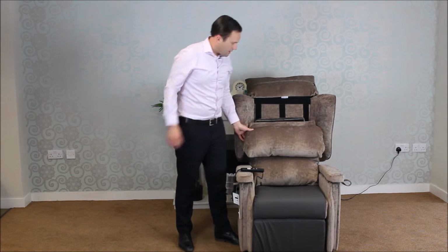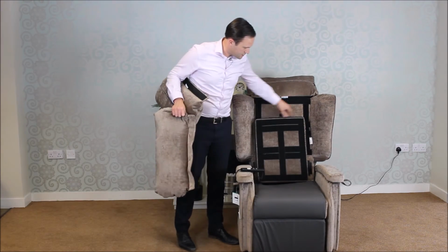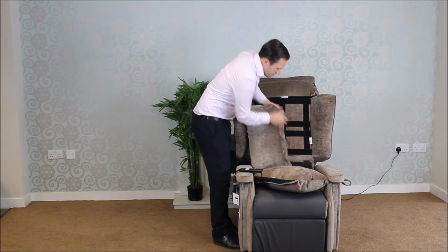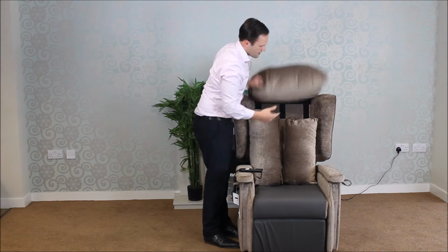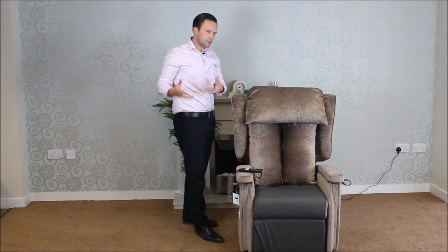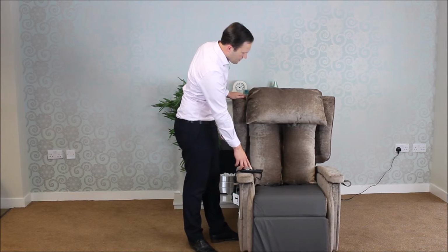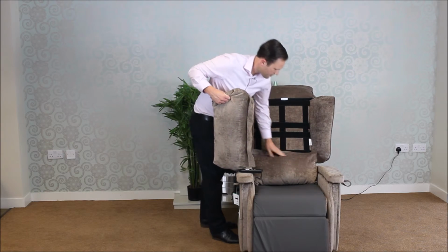Let me just show you another tip on how to accommodate a kyphosis. I'm just going to take the depth adjustment kit out. So for users that have got a kyphosis, sometimes we actually rotate the cushions through 90 degrees, like this. And in this way, it accommodates the kyphosis quite nicely and helps the user to be in a better position to interact, especially when you use the tilt in space. So you can be a little bit creative about what you do with the pillows.